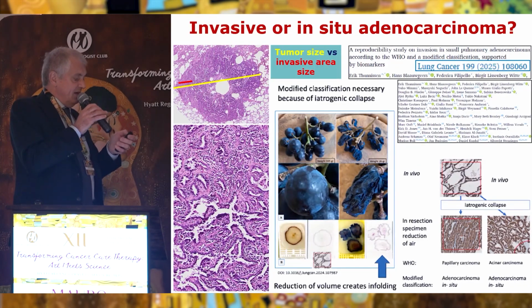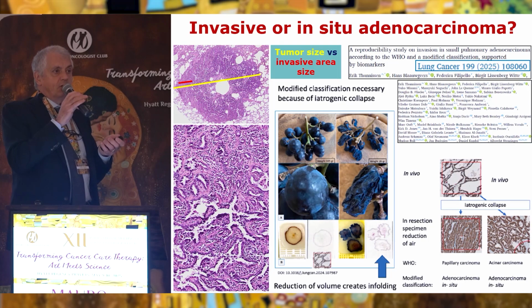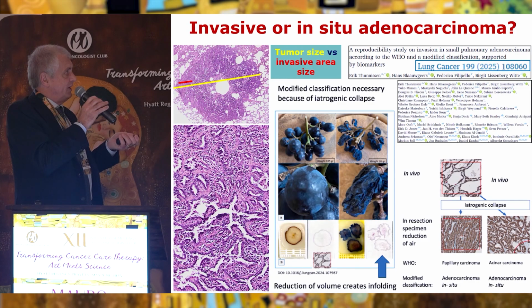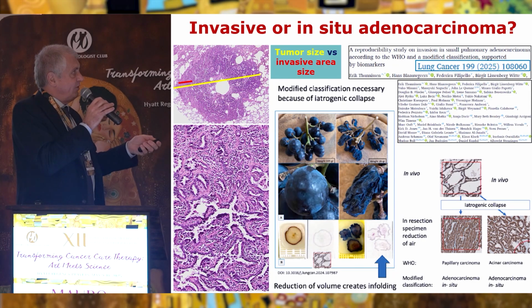So for example, this is a project which I have the privilege to participate in with Dr. Thunnissen in Holland. The study is called the raisin study. I call it raisin study because there is a difference between grapes. Did you see here these big grapes that are in pictures? Okay, those are fresh fruits, but if you use raisins, those are dried raisins.